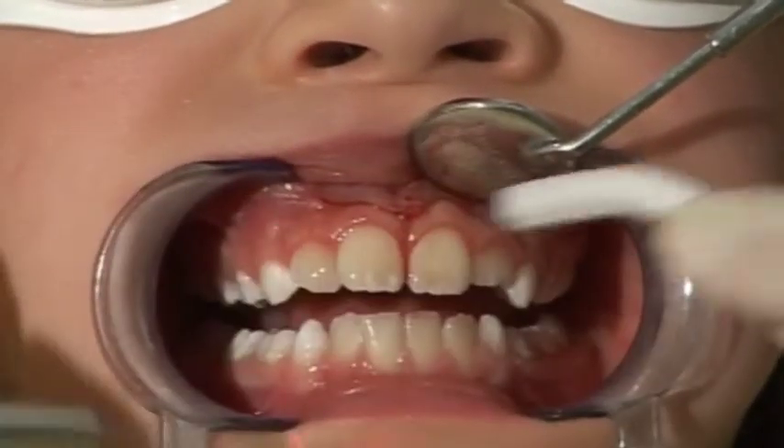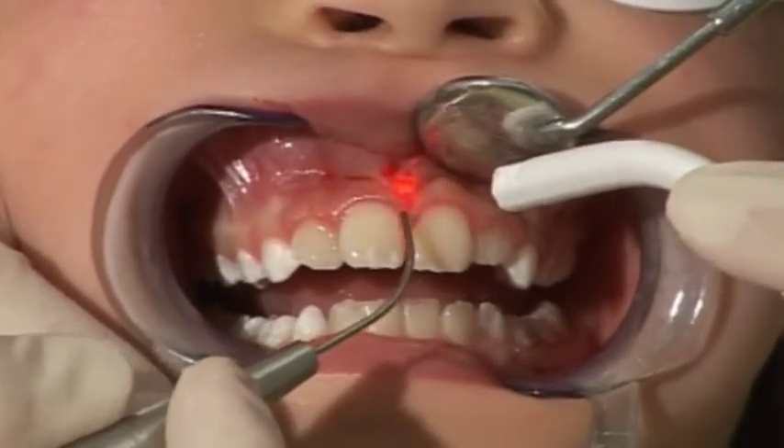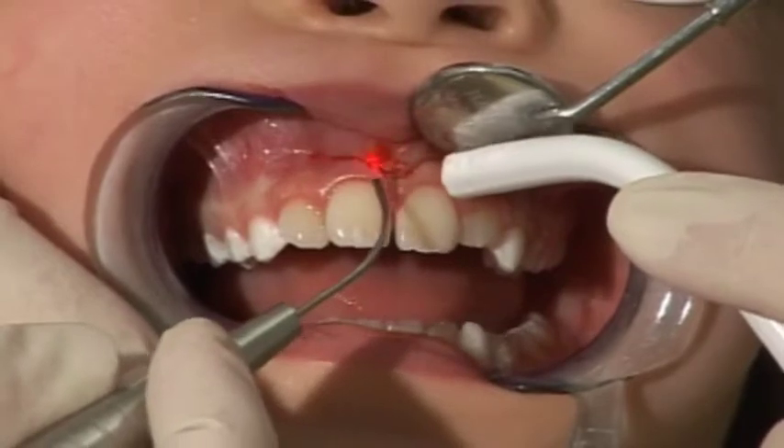Use a 320 micrometer fiber and push it approximately one centimeter out from the single-use tip. Cut through the frenulum using stroking contact movements in a coronal to apical direction.